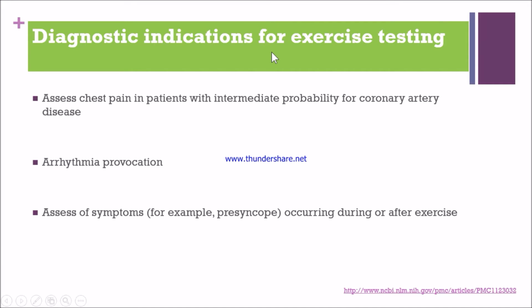Some diagnostic indications for exercise testing. So what are the diagnostic indications? First of all, if we need to assess a chest pain patient who has some coronary artery disease probability, or if the patient is having some arrhythmia, for arrhythmia provocation we go for stress testing.